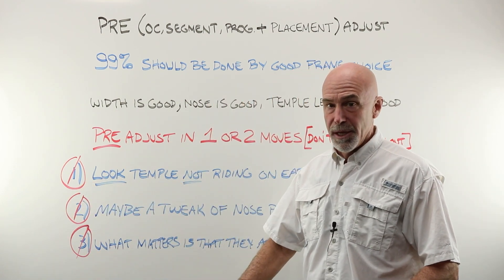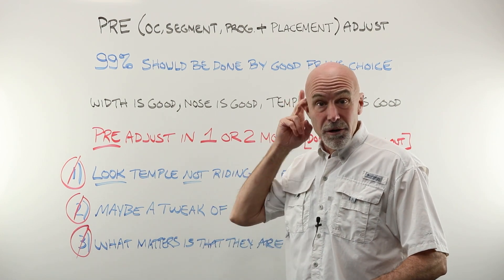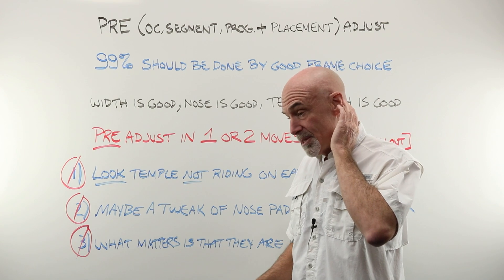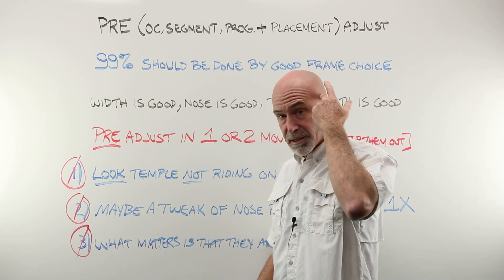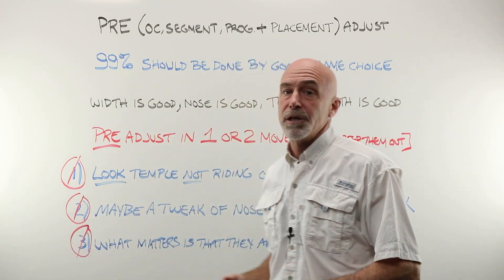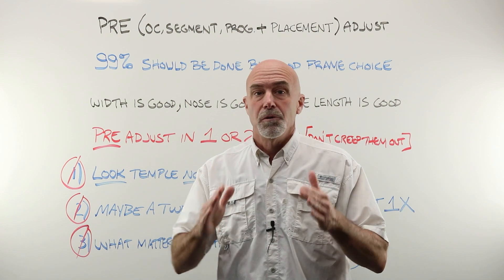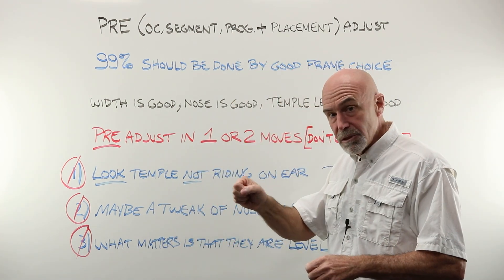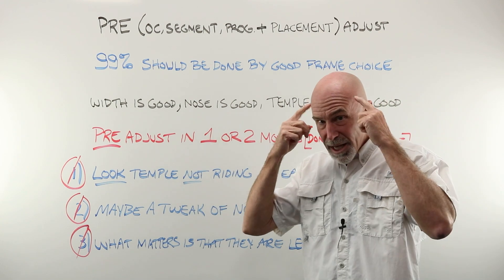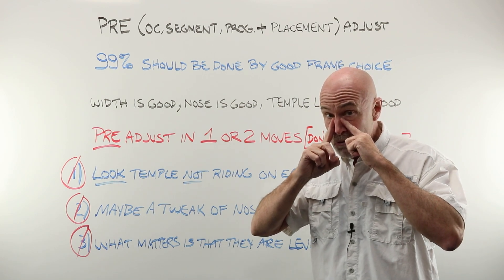You're going to look at three things. Look at the temple — all that matters is that it is not riding up early and pushing that frame up, putting in unwanted tilt. If there's extra that needs adjustment back there and it's sitting on top of the ear, leave that for when you're actually dispensing after it comes back from the lab. Look really closely at the nose — maybe a nose pad needs a little bend, or both need to be brought in just a little bit.